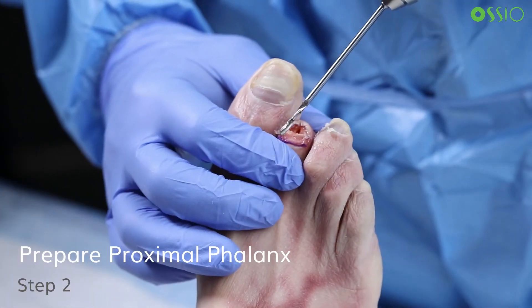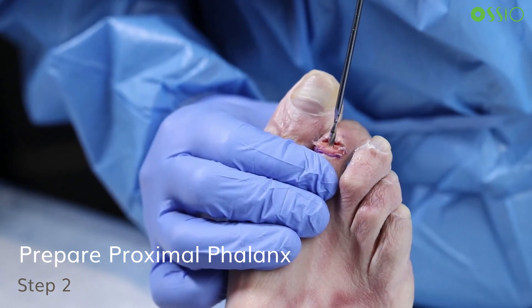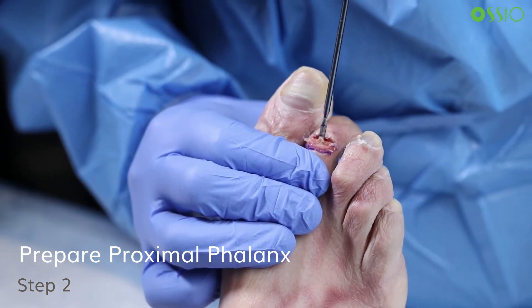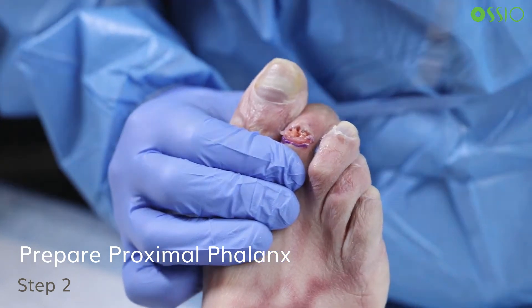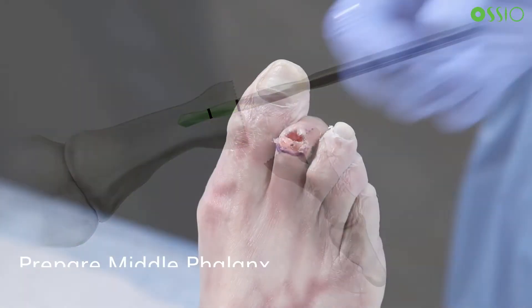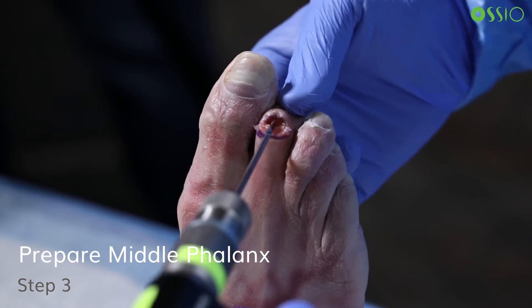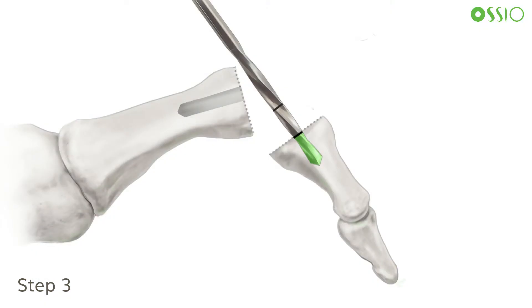Next, centered over the pilot hole created by the k-wire, drill a tunnel in the proximal phalanx using the proximal or second laser line on the drill bit as a visual reference. Bury the laser line on the drill bit in the canal to ensure proper depth. If the middle phalanx is short, drill slightly past the laser line in the proximal phalanx to further bury the proximal side of the implant into the tunnel. For the tunnel in the middle phalanx, use the distal or first laser line on the drill bit as the visual reference for tunnel length.